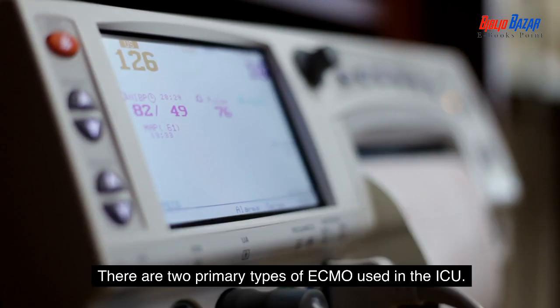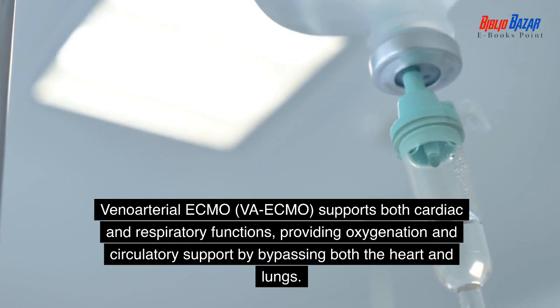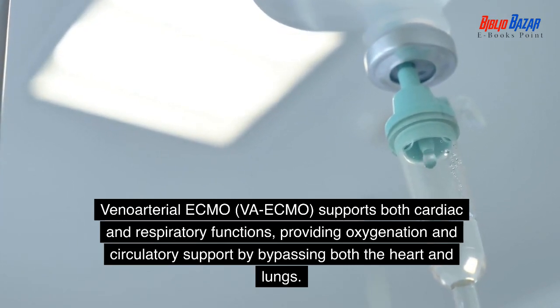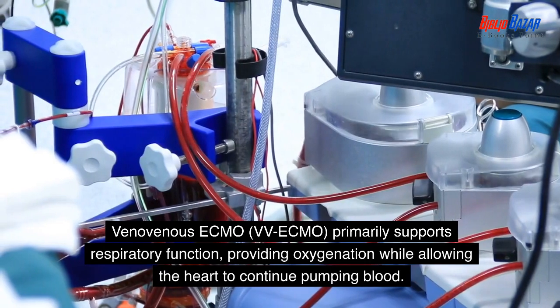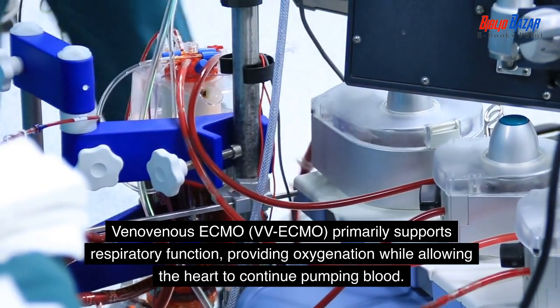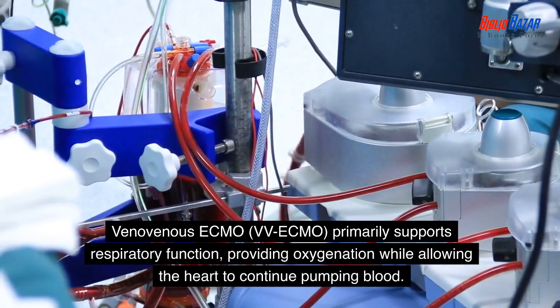There are two primary types of ECMO used in the ICU. Venoarterial ECMO, VA ECMO, supports both cardiac and respiratory functions, providing oxygenation and circulatory support by bypassing both the heart and lungs. Venovenous ECMO, VV ECMO, primarily supports respiratory function, providing oxygenation while allowing the heart to continue pumping blood.